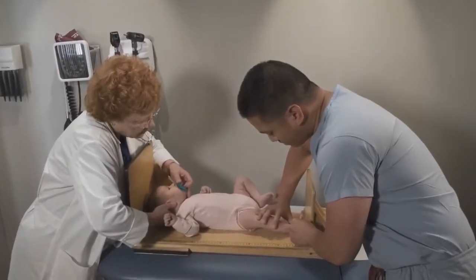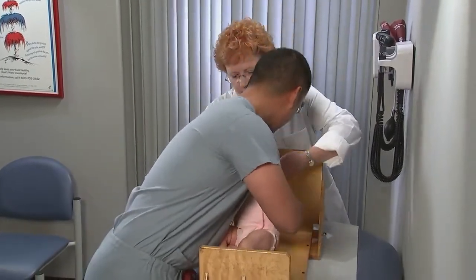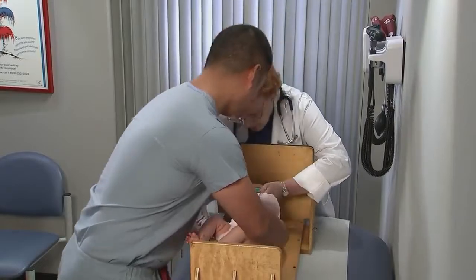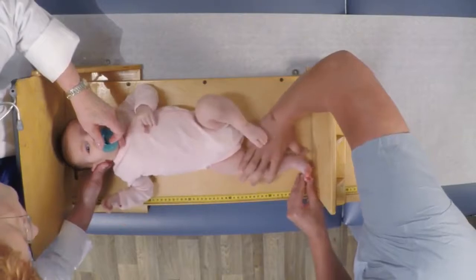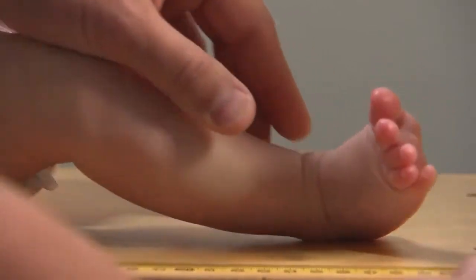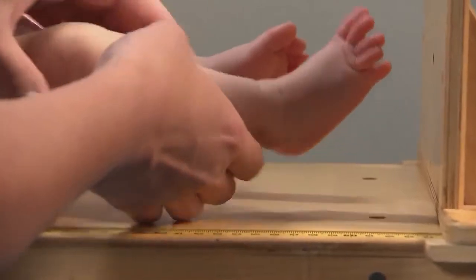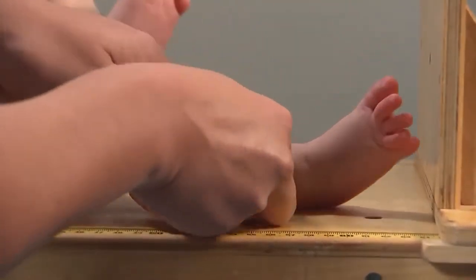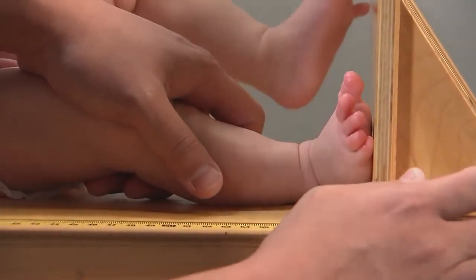Measuring length ideally should be completed by 2 healthcare providers. To measure length, lay the infant face up on an infantometer. The first healthcare provider correctly positions the newborn's head against the head plate and gently holds the head in this position. The second healthcare provider gently presses the infant's knees to straighten the legs. Then he or she should press the bottom of the foot onto the foot plate so that there is no gap between the foot and the foot plate. Record the length of the infant by reading the measurement on the infantometer.